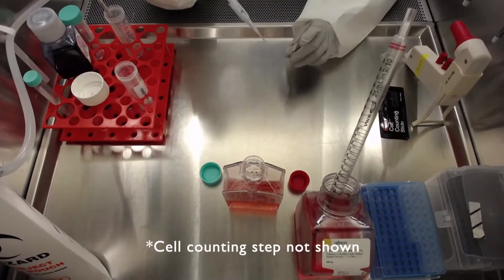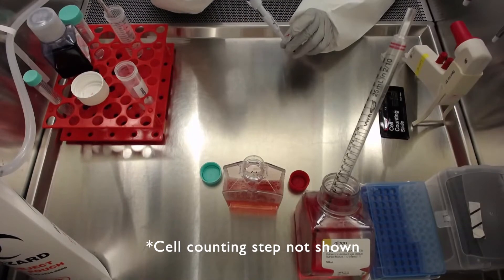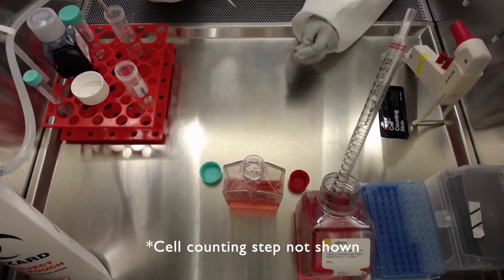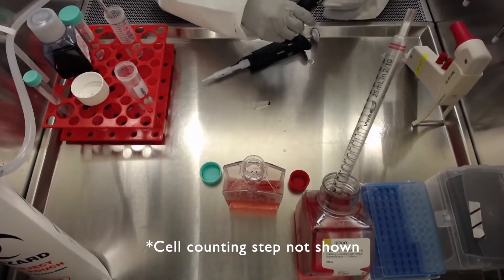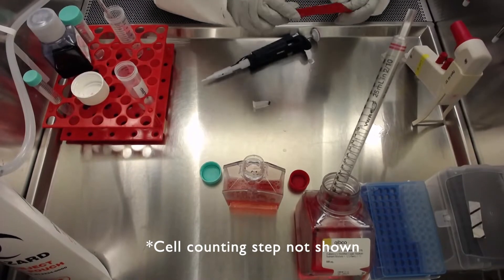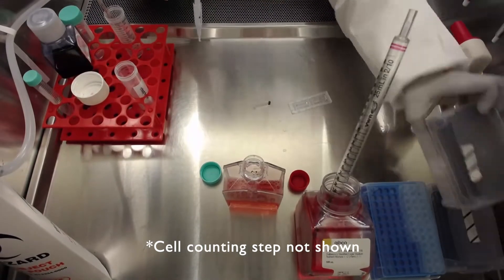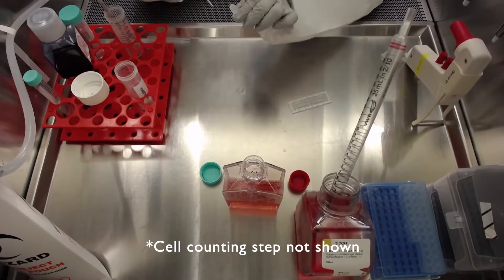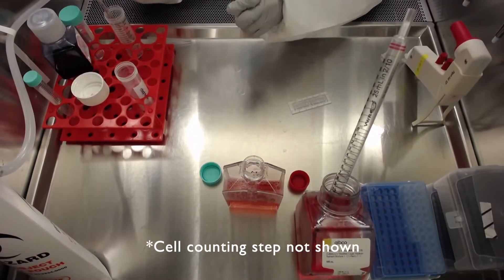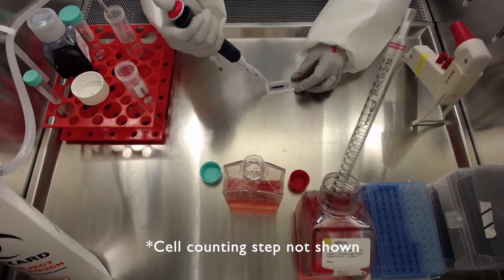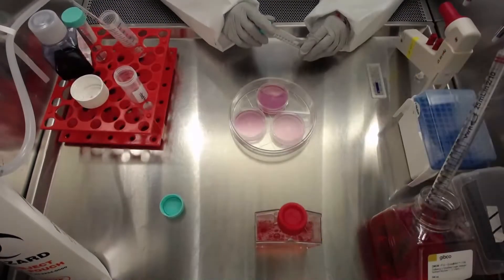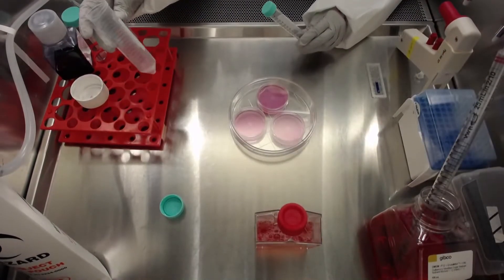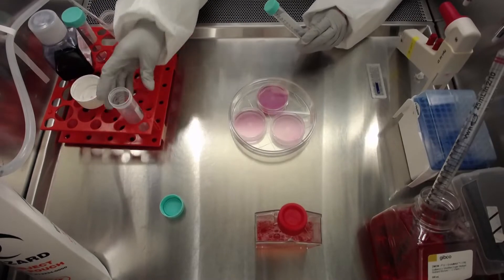Next, count the cells and evaluate the cell viability with trypan blue that you previously aliquoted. An appropriate viability percentage is around 95% of live cells in the cell suspension. Once you have estimated the cell count, prepare a mix of 9.5 million live cells in 1.5 milliliters of neuronal induction media with rock inhibitor.